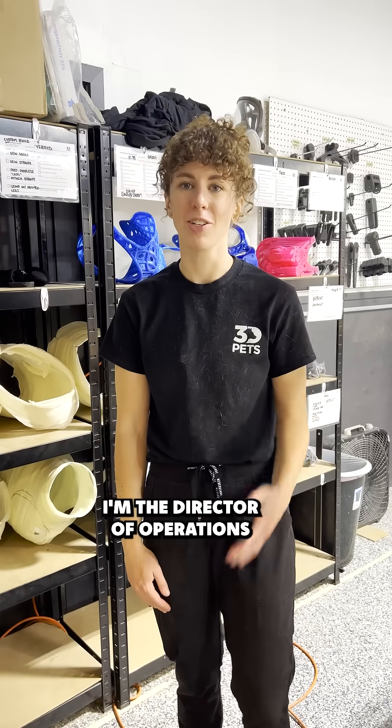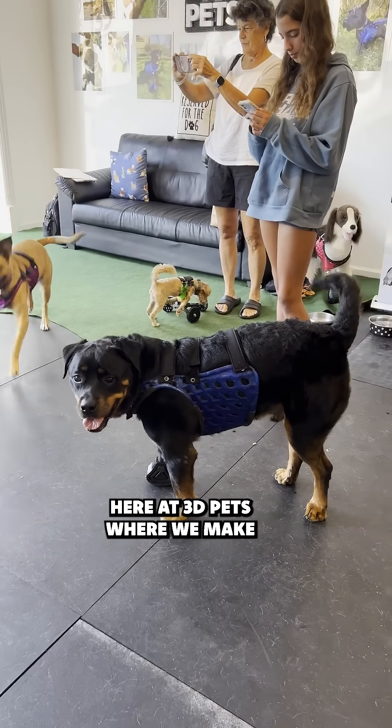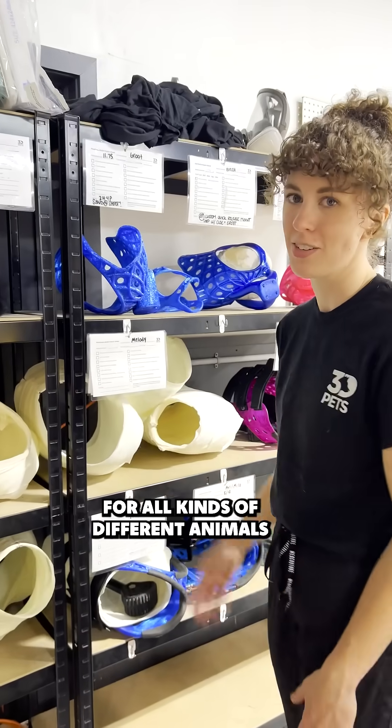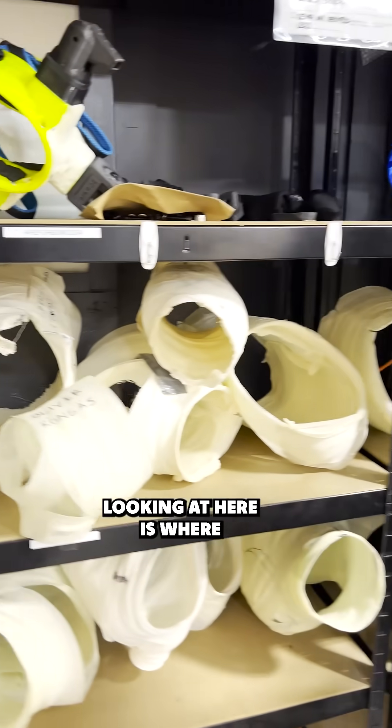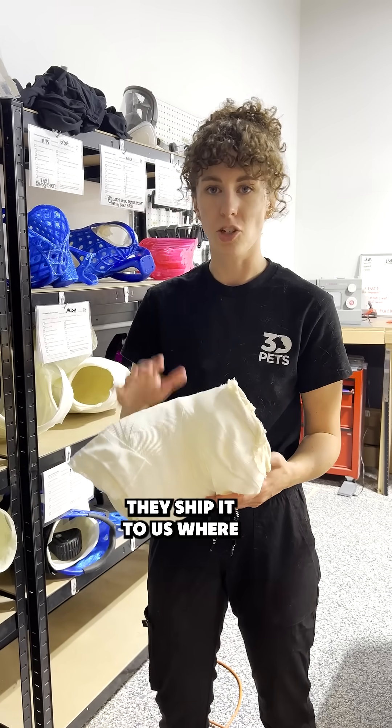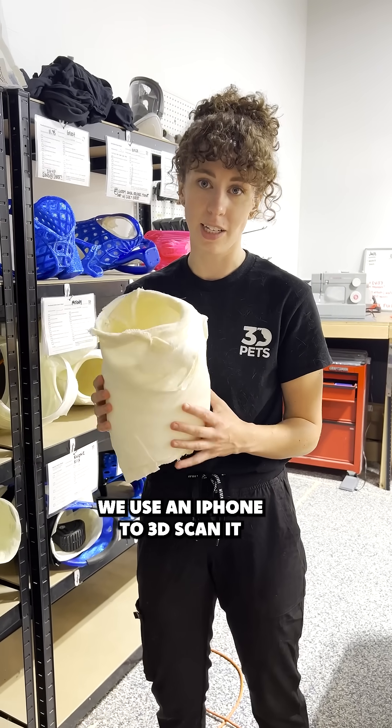Hi everybody, my name is Lydia. I'm the director of operations here at 3D Pets, where we make custom animal mobility devices for all kinds of different animals. So what you're looking at here is where our process starts. We receive a custom mold for each animal that's done at home, and they ship it to us where we use an iPhone to 3D scan it.